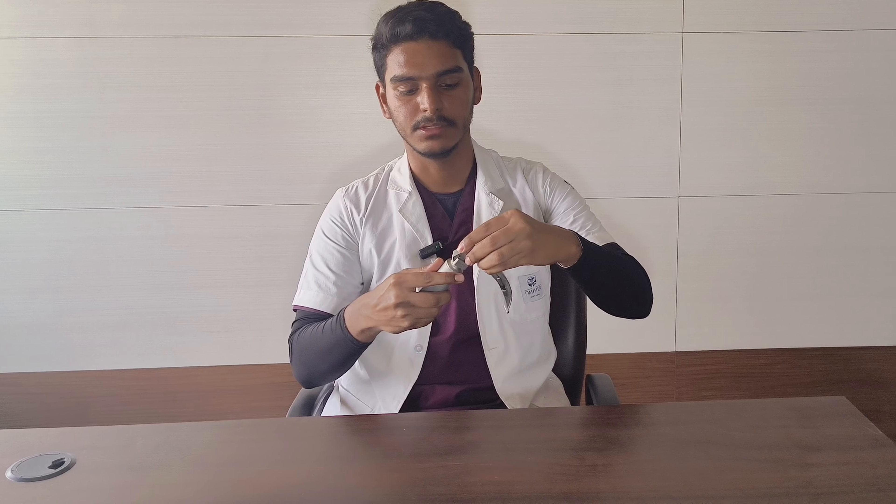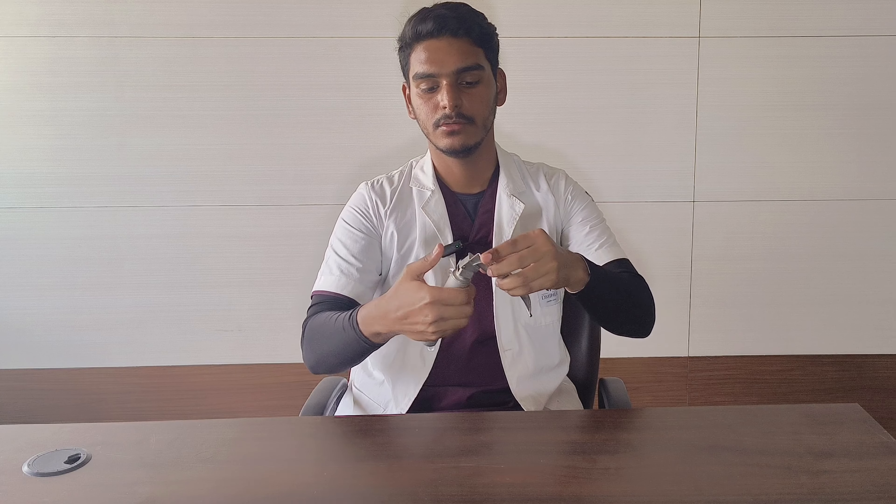Just like this — as you can see, the leads are in position. When I assemble the laryngoscope, this lead gets attached to the lead connected to the battery present in the handle, which acts as the power source. When these two leads come into contact, the light source turns on. I am going to put a thumb here and give a gentle push upwards — and as you can see, this is on. Your laryngoscope is now ready to use.